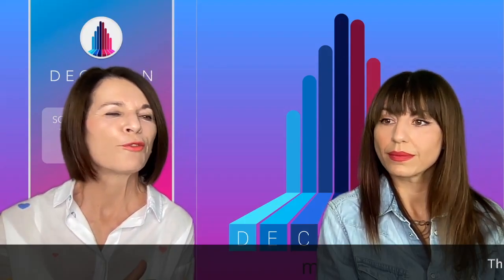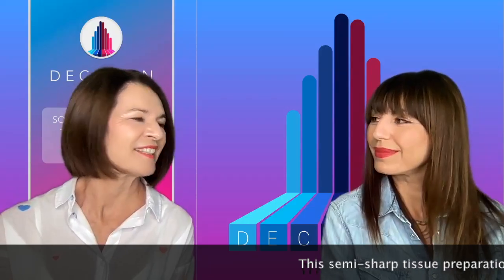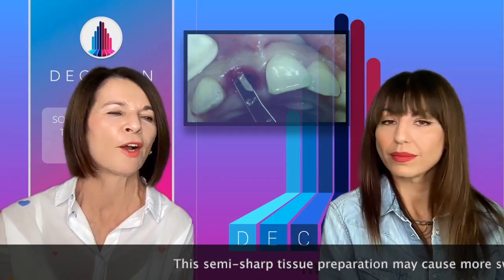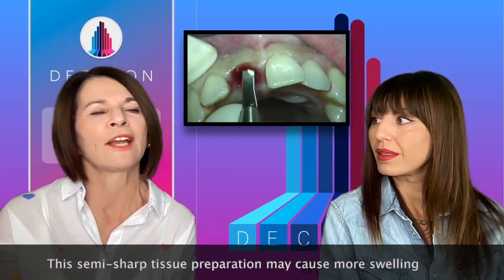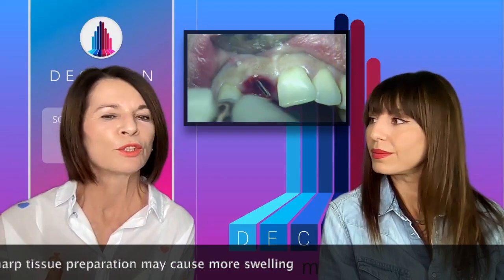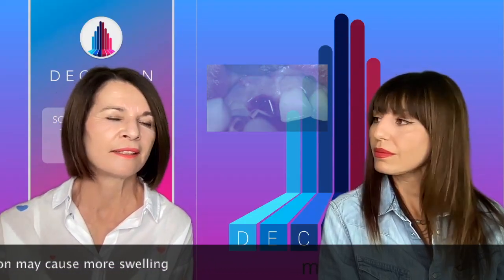And when you use a tunneling knife, you simply feel the releasing of the tissue, and you feel some fibers, how you are pushing them until you actually destroy them, break them. You don't make a nice clean cut. And this is the reason for more swelling.